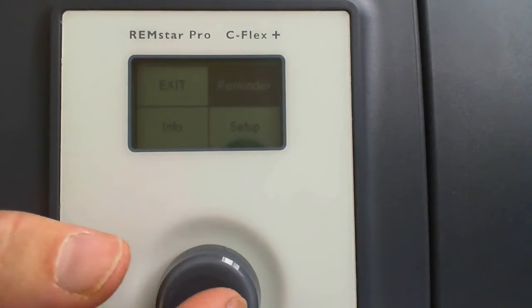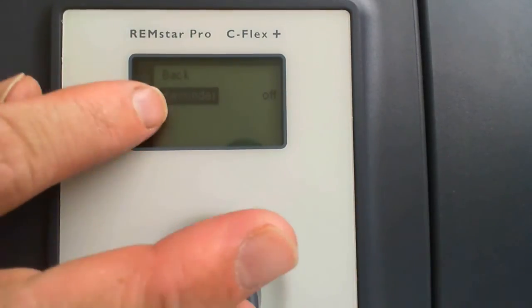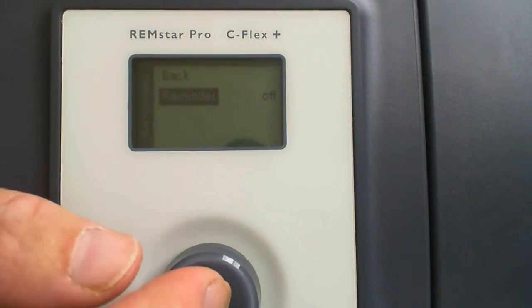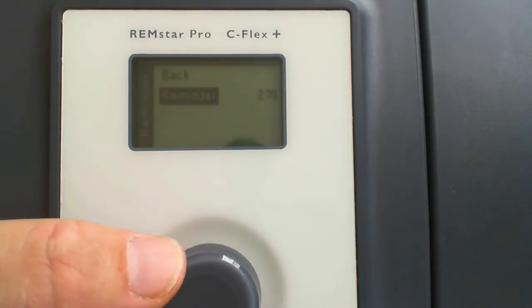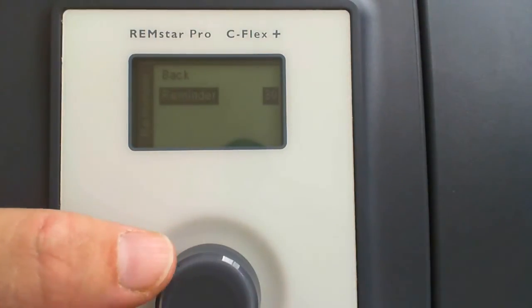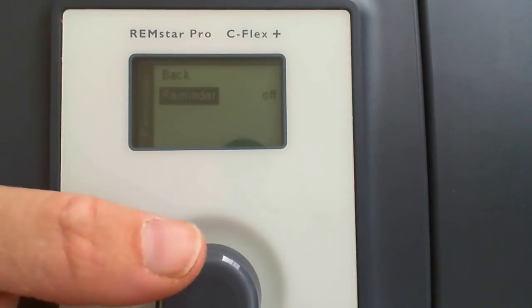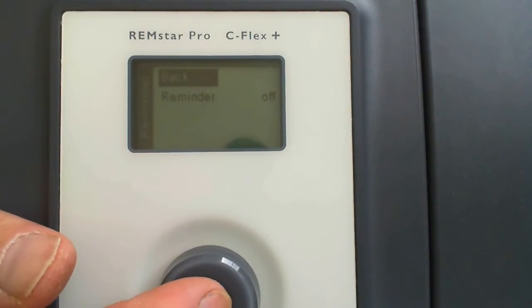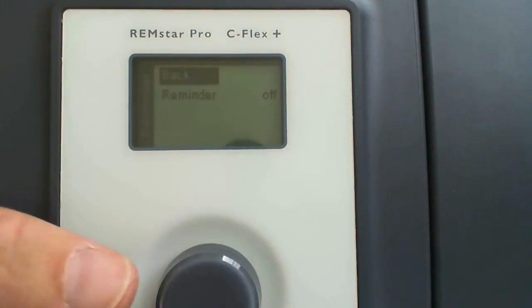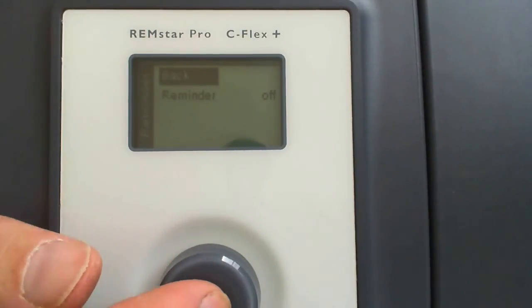So the first one I look at, because it's the easiest, is this reminder. Now this reminder really is just more or less a sales tool. When you select it, you have off, but then you also have the number of days to a reminder. Basically, if your insurance is paying for stuff every 30 days, or every 90 days, you're going to be able to go in here and set this up to remind you. It's kind of a sales tool.